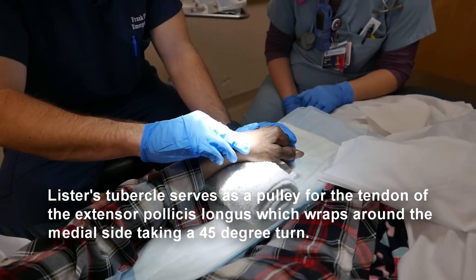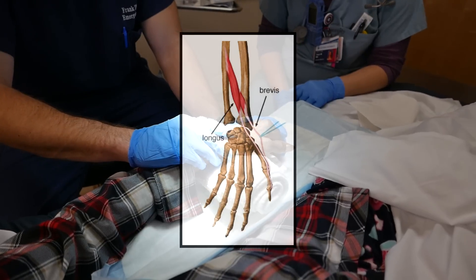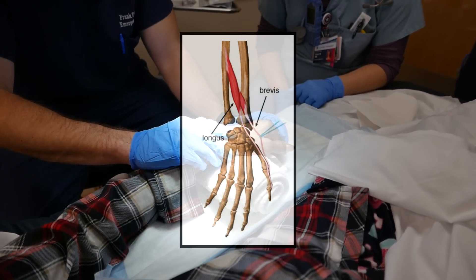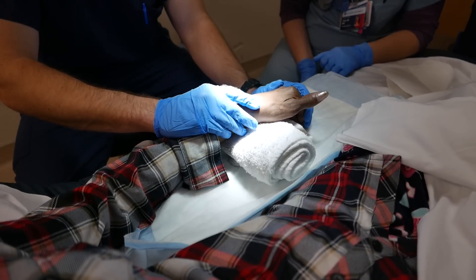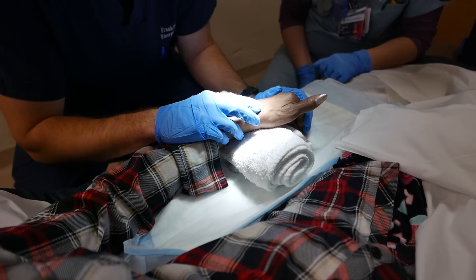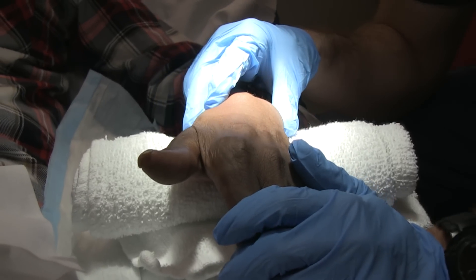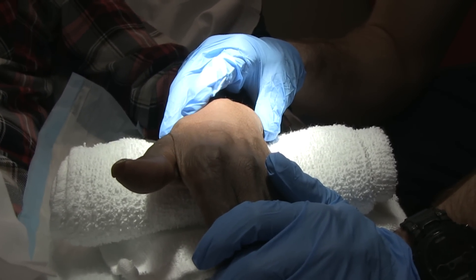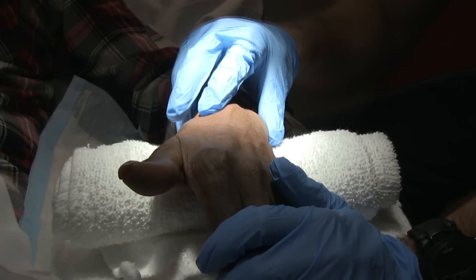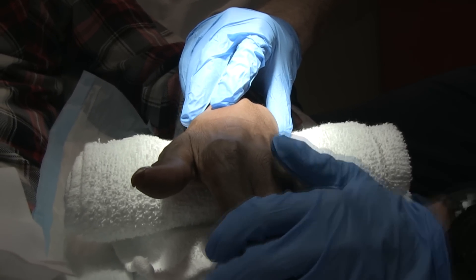Right through Lister's tubercle runs EPL, which I can feel very well. If she extends — can you give me a thumbs up, ma'am? — I can feel EPL moving. If I pull back the skin you can see it tracking right there. So you're just going to go on the ulnar side of the extensor pollicis longus. I'm feeling EPL right here, and now I'm moving ulnarly to where I find the joint space has opened up nicely from the ulnar deviation and flexion.